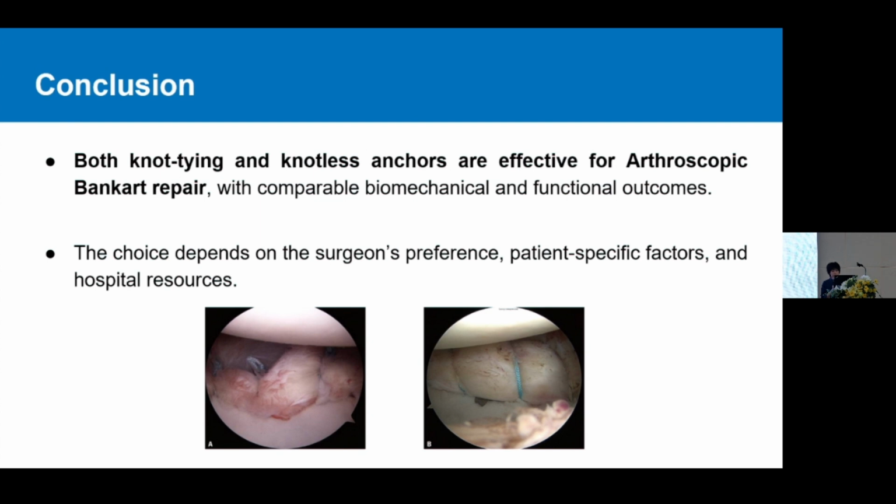In conclusion, both knot tying suture anchors and knotless suture anchors are effective for arthroscopic Bankart repair with comparable biomechanical and functional outcomes. So the choice depends on the surgeon's preference, patient-specific factors, and the hospital resources.